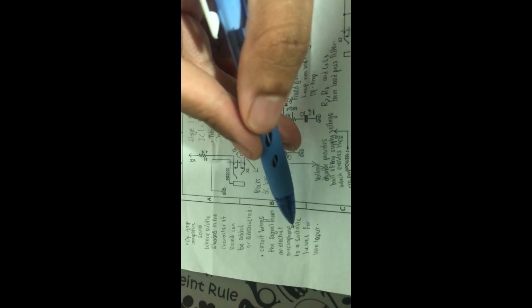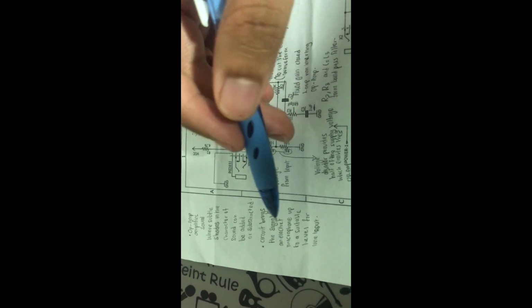The circuit brings the signal from an electret microphone up to a suitable level for line input, which is basically how this stage 1 actually works. And not just stage 1, but the whole circuit works. So let's see part by part. Let's break down the first stage part by part.